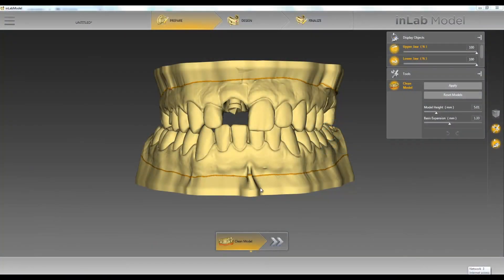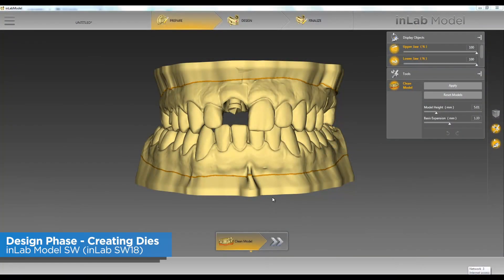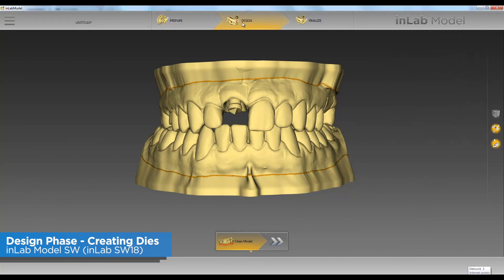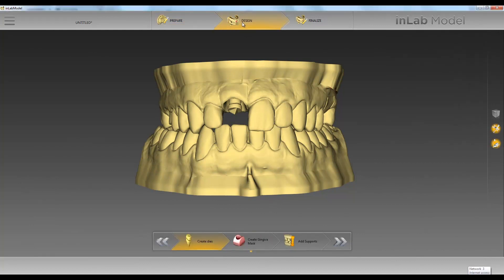Hello, this is Jay Black with Tekken 2. In this video, we're going to go over the design phase of the in-lab model software. After we've cleaned our model, we're going to click on Design at the top.